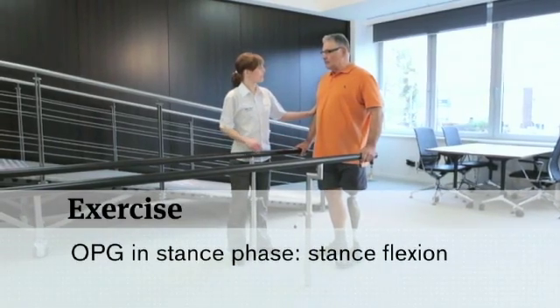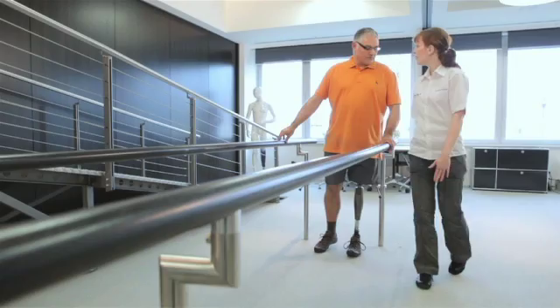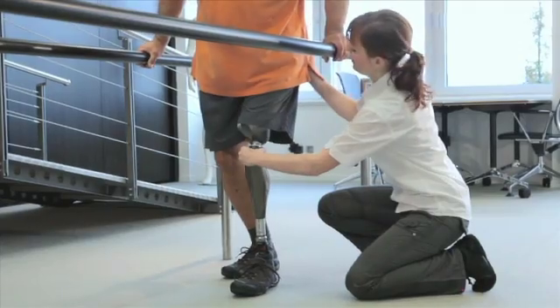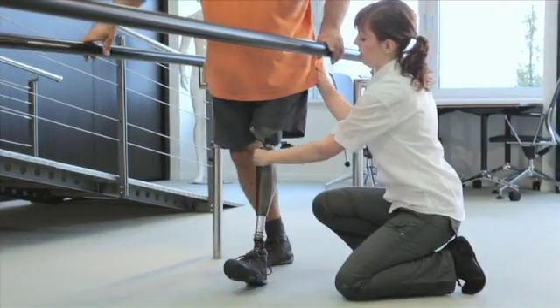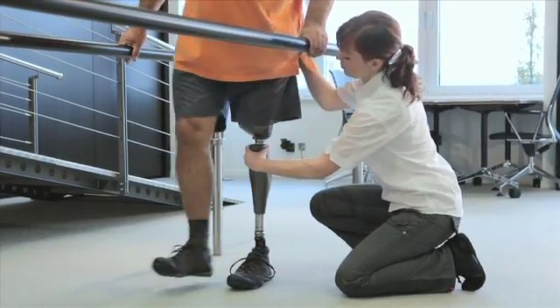Stance flexion while walking can initially be trained in a static situation. Guide the knee and the socket and have the user bend and load the prosthesis. The user should feel that the resistance is increasing to control knee flexion. Try this in a later stage in a more dynamic situation.